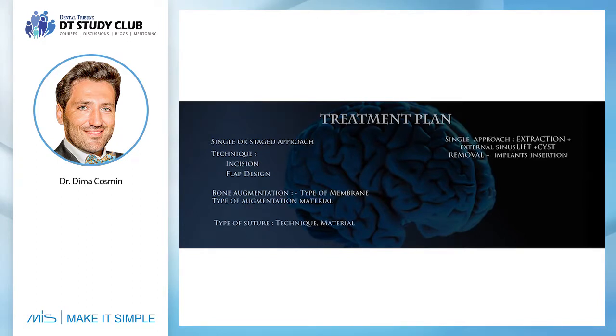In this case, single approach. We start with extraction. At the same time, external sinus lift, cyst removal, and implant insertion. Everything in one session. Of course, if it's possible, I want to end the surgery in only one session, even if it's very complex. And I try to treat my patients like I am the patient. And of course, if I would be the patient, I would like to have only one surgery to solve every problem and to be as easy as possible.